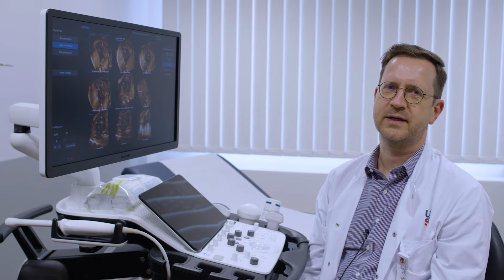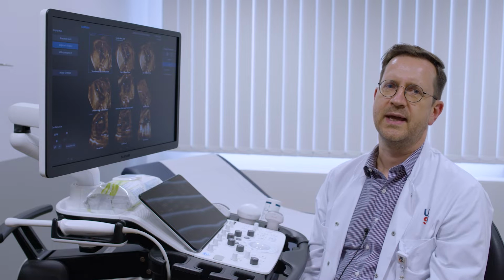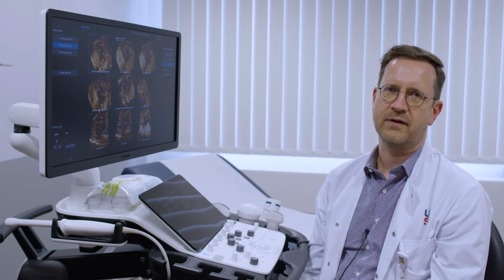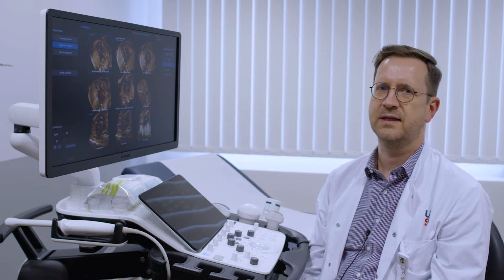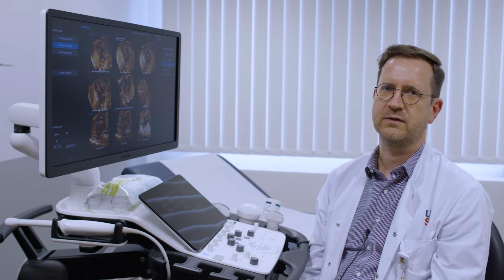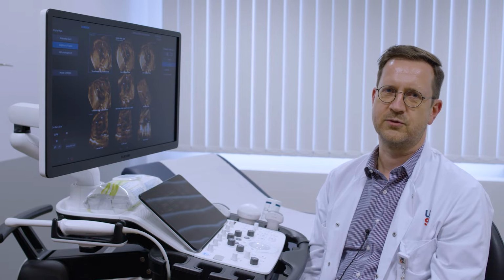What we're going to talk about today is biometric assistance and automatic assessment of biometric parameters. We further focus on the assessment of cardiac structures, either in B-mode ultrasound or in color Doppler ultrasound. Finally, we will apply a semi-automatic technique, the 5T heart technique, to automatically reconstruct cardiac structures. And this is what we're going to do today.